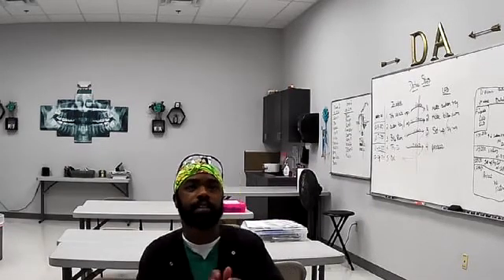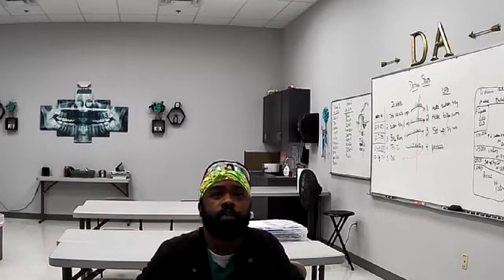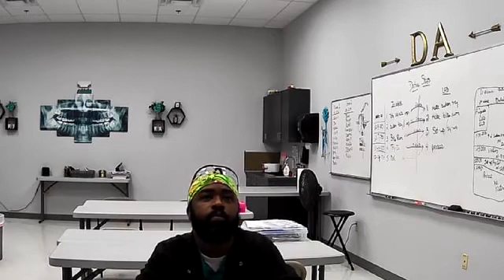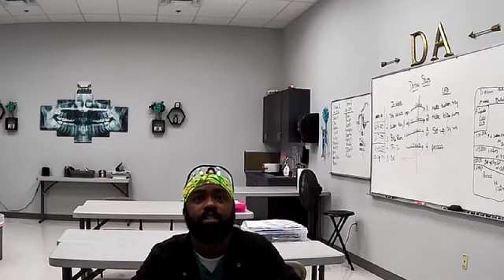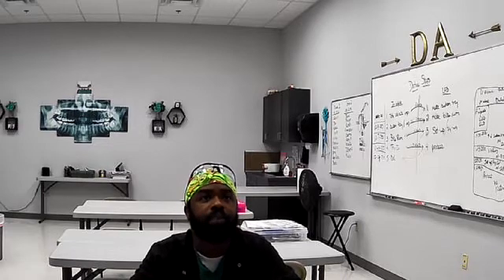A full mouth survey X-ray is composed of a series of individual images, including a combination of bitewings and periapicals. Usually, full mouth X-rays are taken when you're a new patient at your dentist's office. They use these initial images as a baseline on the health of your mouth.